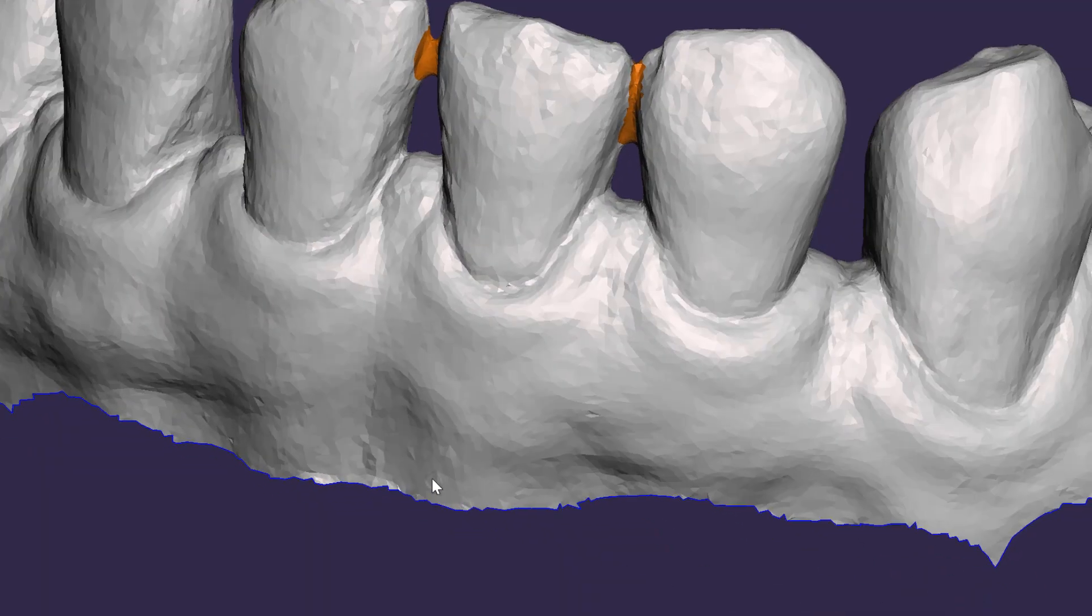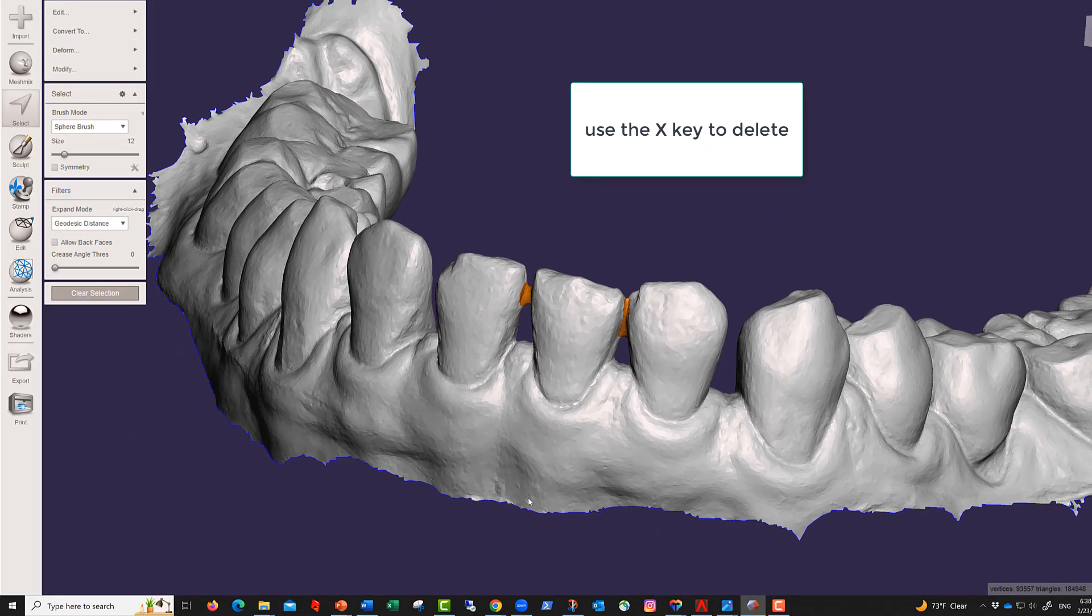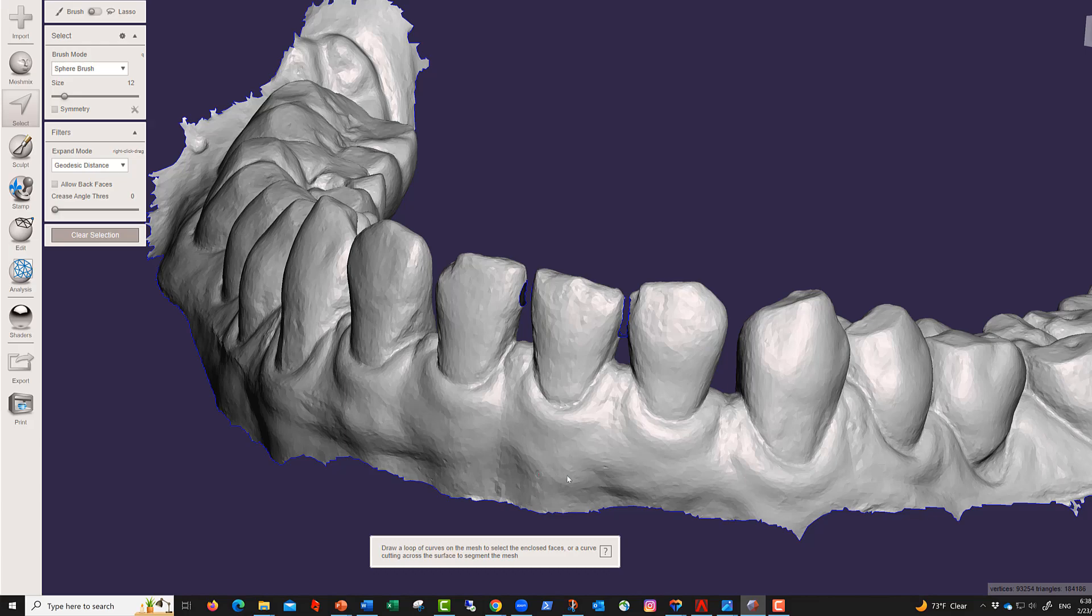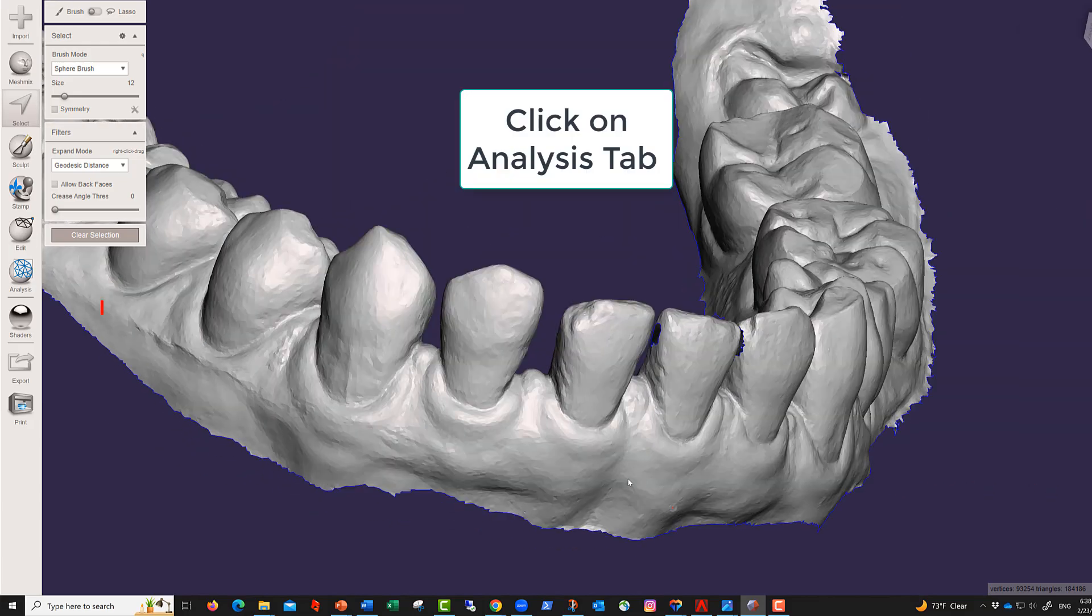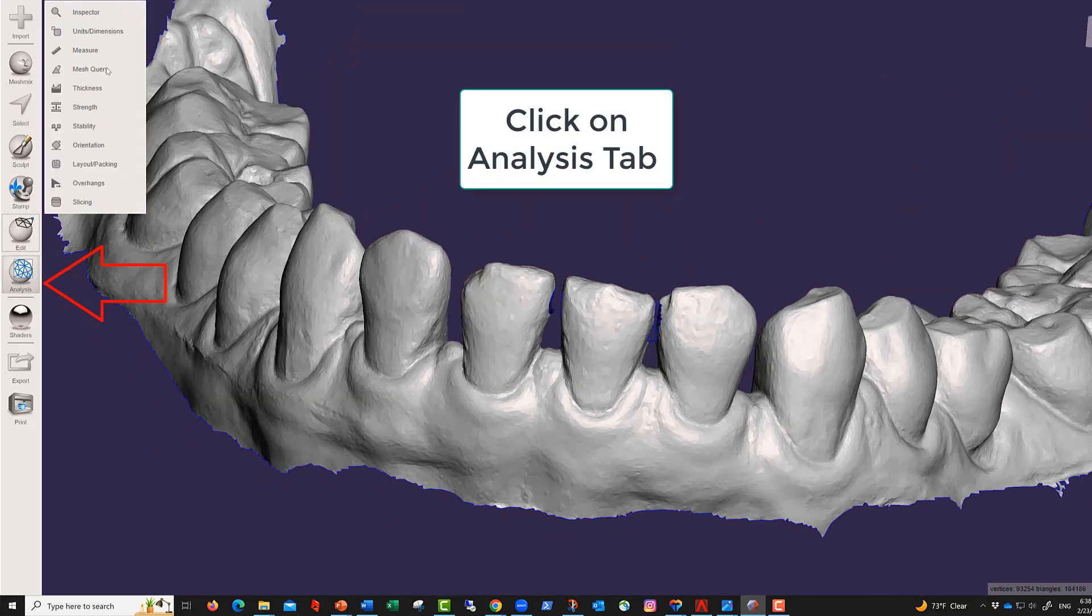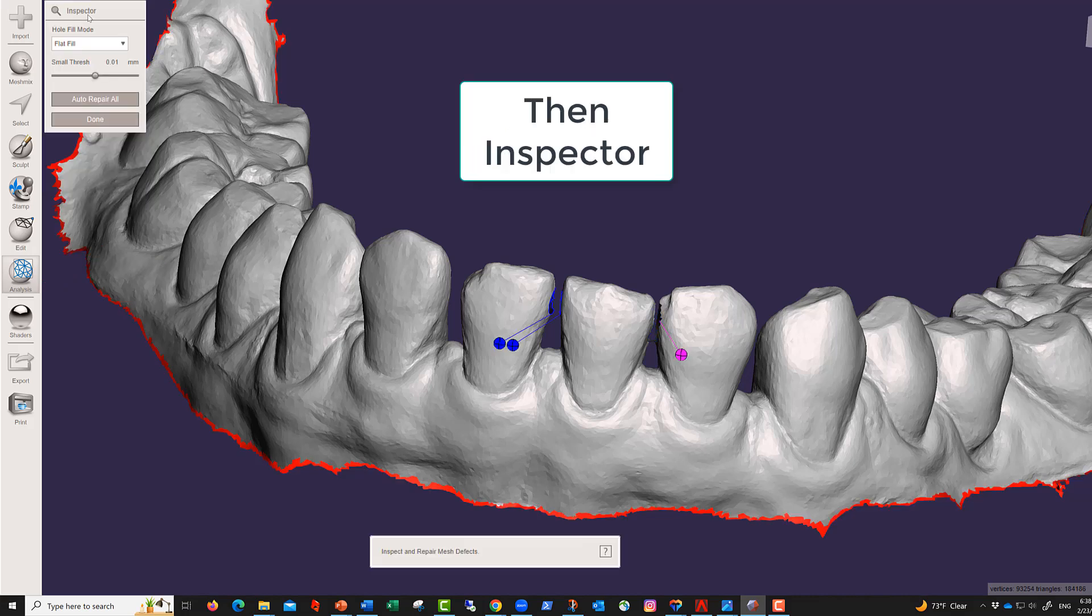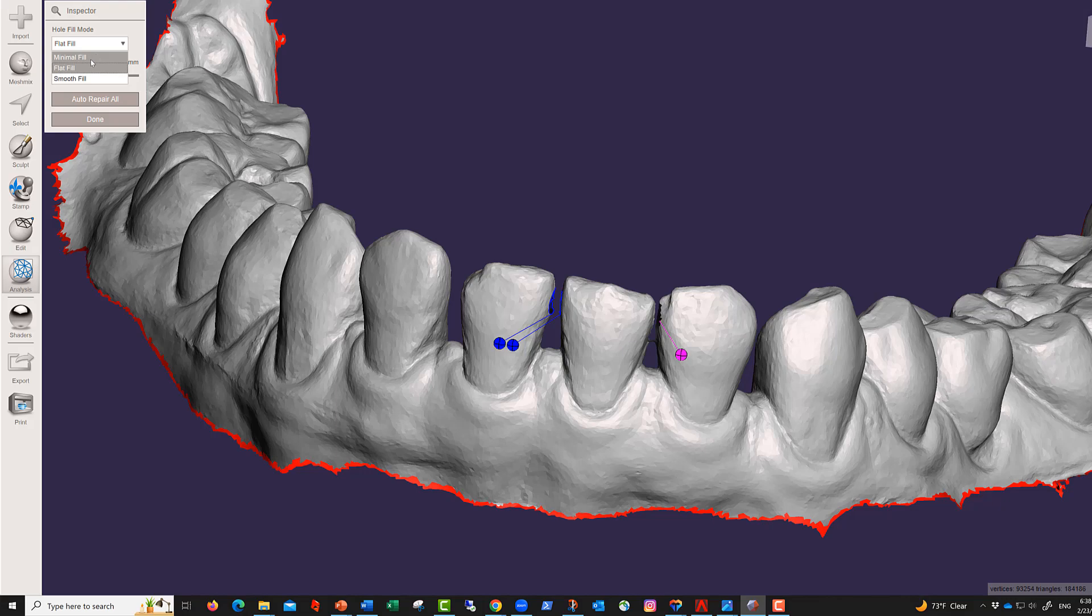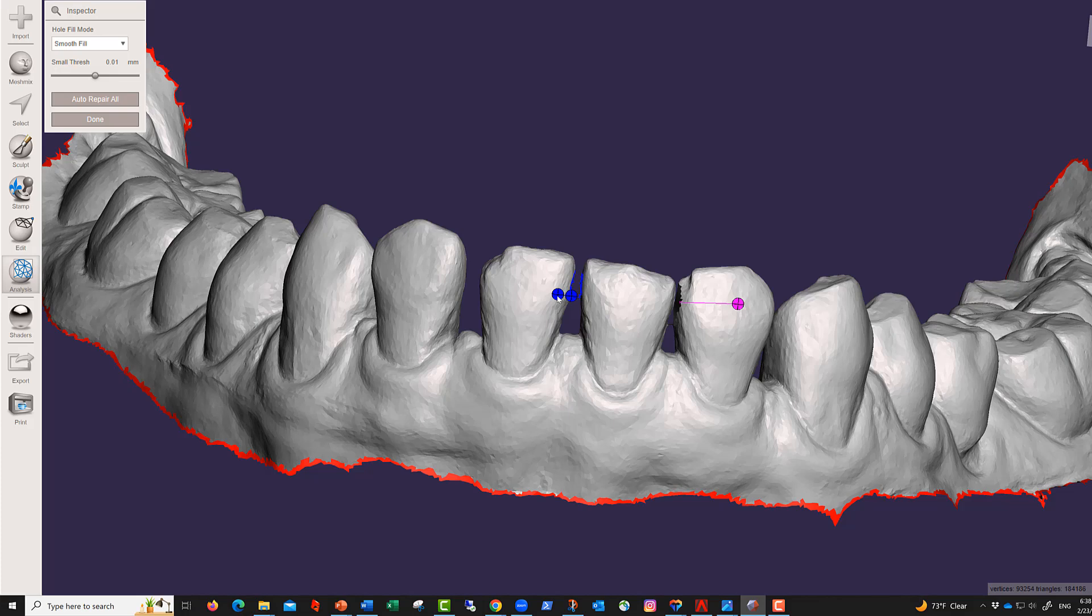Now we have this, so then I'm going to be deleting this. And the problem that we have now is we have four holes. Analysis inspector, and I will fill the holes with a smooth fill. And you can see that now I can click here and here.